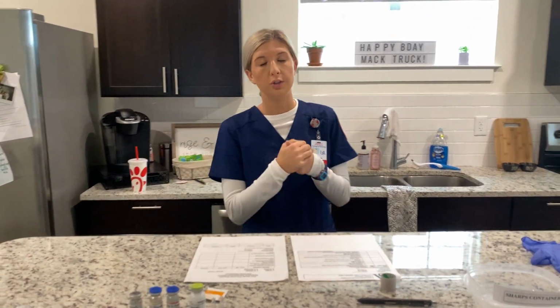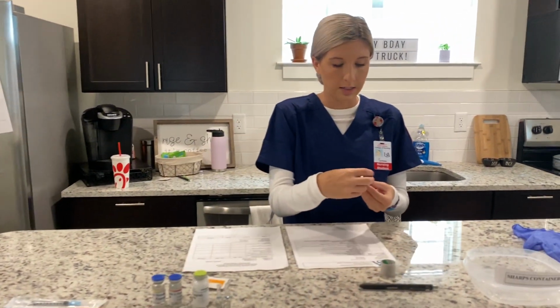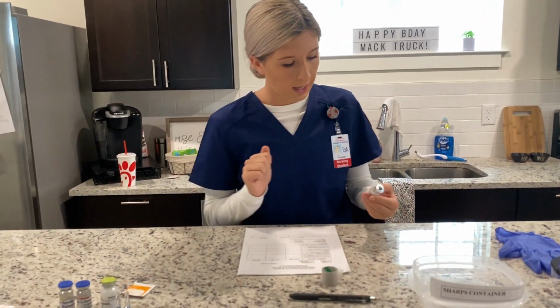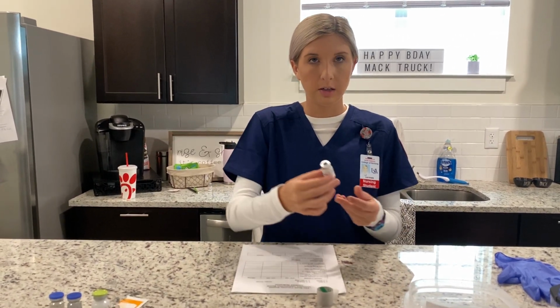So next I'm going to perform hand hygiene, and I'm going to select my right medication. So I select the heparin, and I see that it is also heparin on the MAR, and that the expiration date is 12/5/2025, so it's not expired. I'm going to show you.